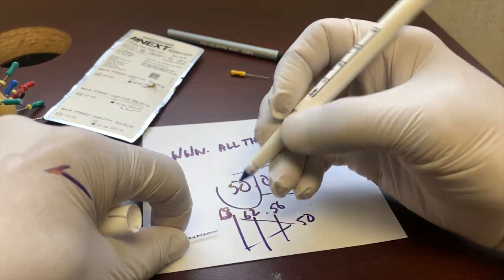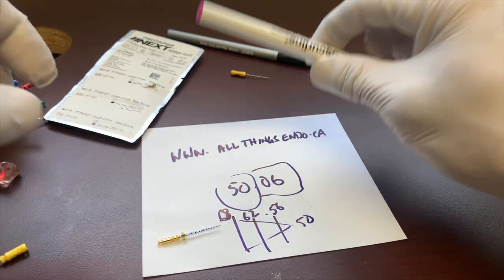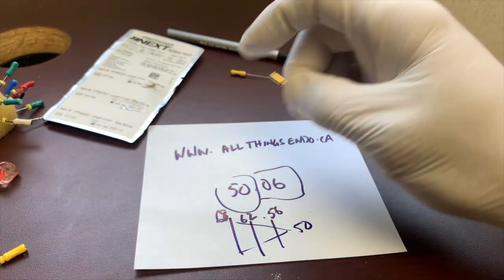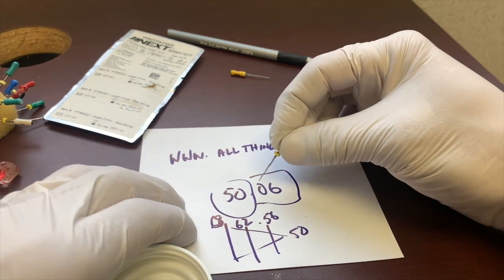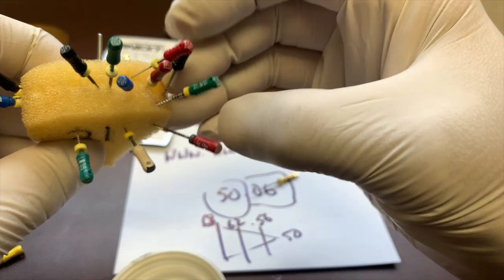68, correct. Okay, so 68. So we know that 3 mils back is roughly a 68. So the reason why I'm doing that is just to give you an idea of how I calculate your apical prep, even with these rotary files. If you have any questions, go ahead and put them in the comments below. I'm gonna whip through this.